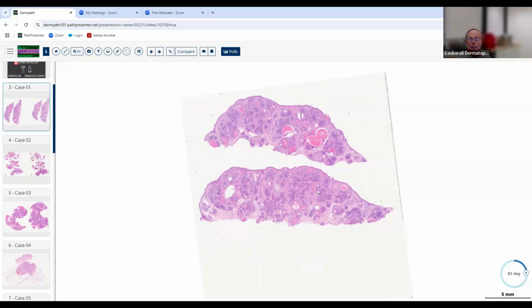So anyway, it's a neoplasm. Why? This sounds tautologic, but you can see that there are obviously neoplastic cells here. If we see only inflammatory cells at low magnification, we say it's probably inflammatory, although lymphomas and things like that have inflammatory cells but are neoplastic conditions. But we can see that these are clearly not lymphocytes, neutrophils, or anything like that. So that's really the answer. Is it inflammatory or neoplastic? There are non-inflammatory cells in the lesion, so we know it's got to be a neoplasm of some sort.